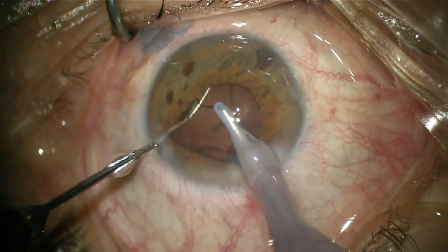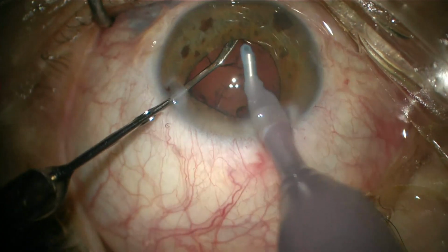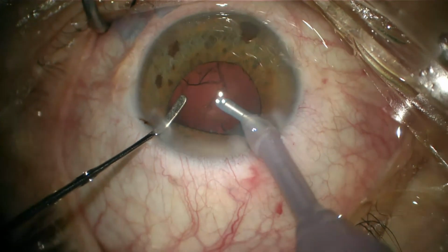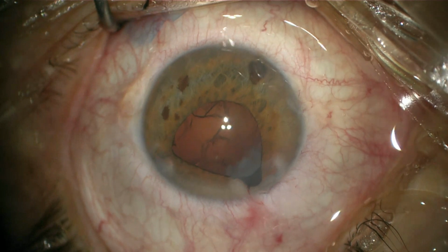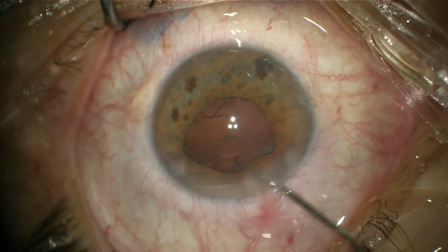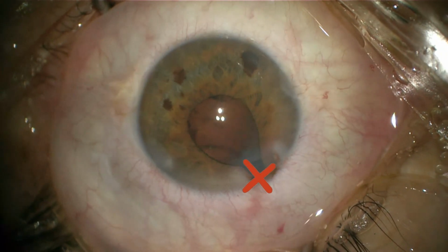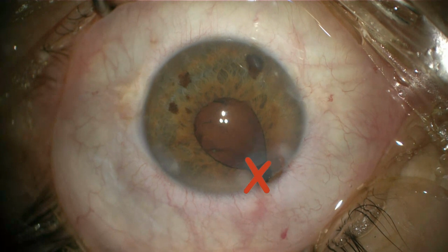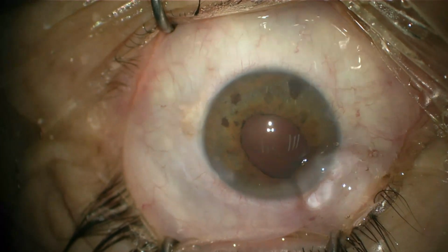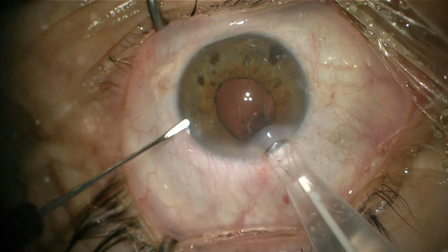But when it happens in the middle of the surgery, you need to be patient and try not to lose the situation. Don't be too obsessive removing all small pieces of cortex, because here is where many of the complications happen, and you can eventually prolong a surgery with limited outcomes or at least not the same ones. Never flush through the main port incision when you want to irrigate BSS to remove the peripheral cortex. Putting the IOL in the back always helps to protect the capsule in this scenario, even before removing the cortex.